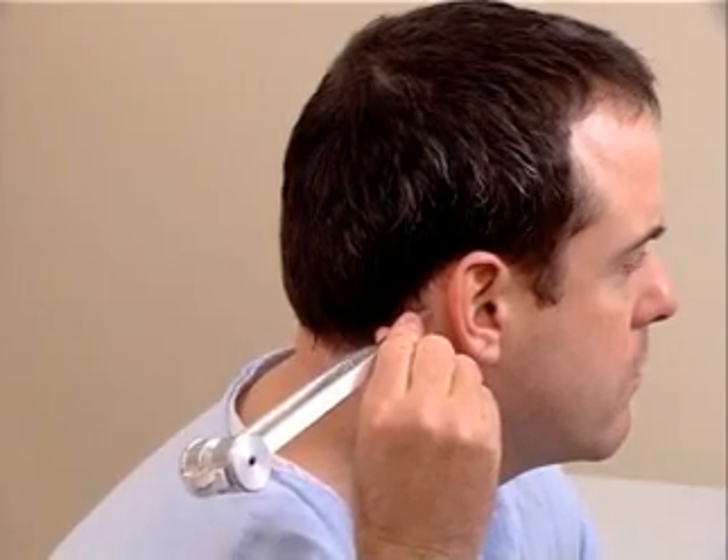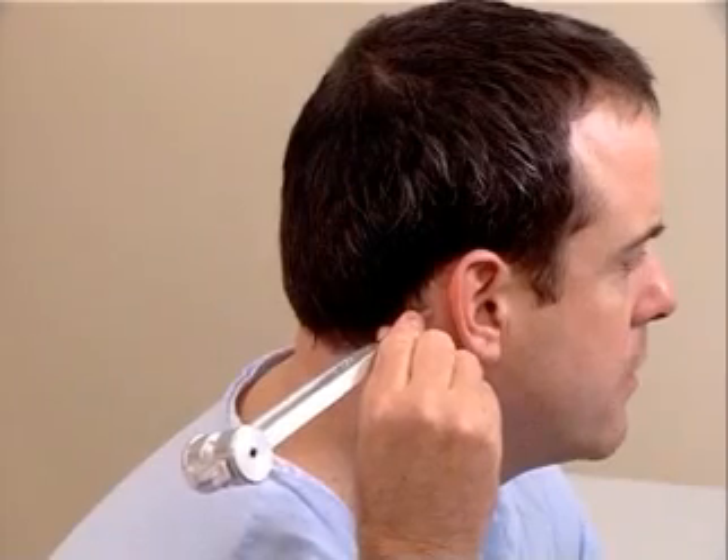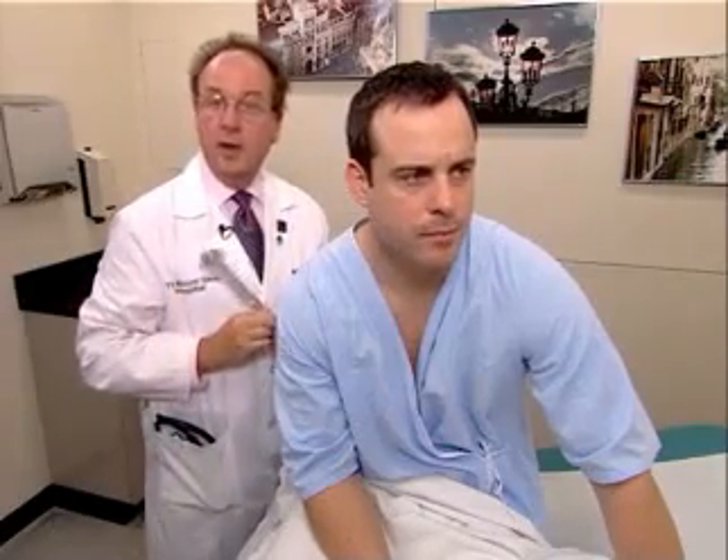Mr. Johnson, do you hear or feel anything? Yes. Okay. Tell me when you stop hearing it or feeling it. I stop. Okay. What about now? I can hear it. Okay. So air conduction is greater than bone conduction, and that's normal. A-C greater than B-C.